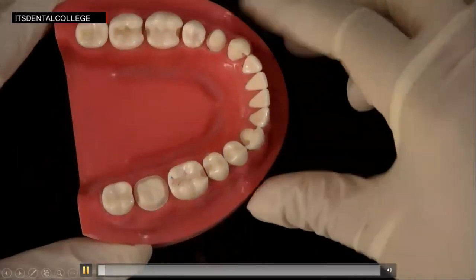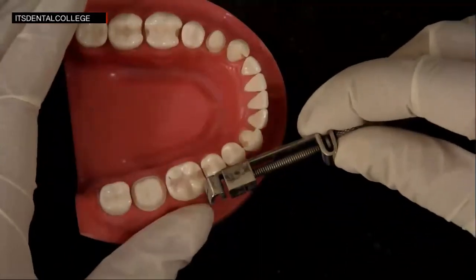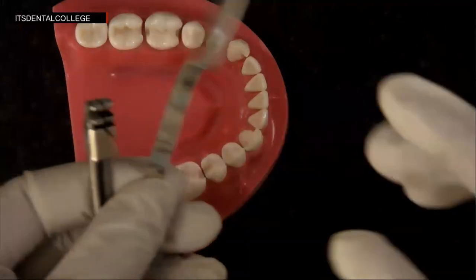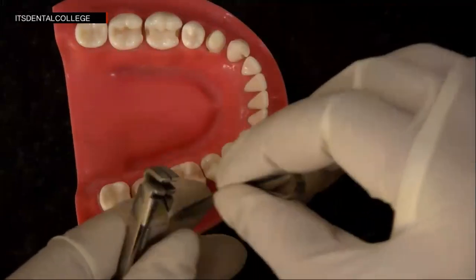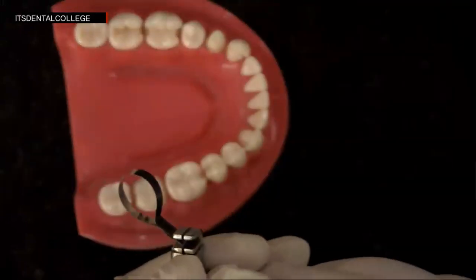So we will be discussing the placement of a Tofflemire retainer on tooth number 46. This is how we have to place it. The slot has to always come gingivally. These are the guide slots into which the band, the loop, we'll make a loop of the matrix band, and then we will either move it to the right or left side depending on the quadrant that we want to place it in.